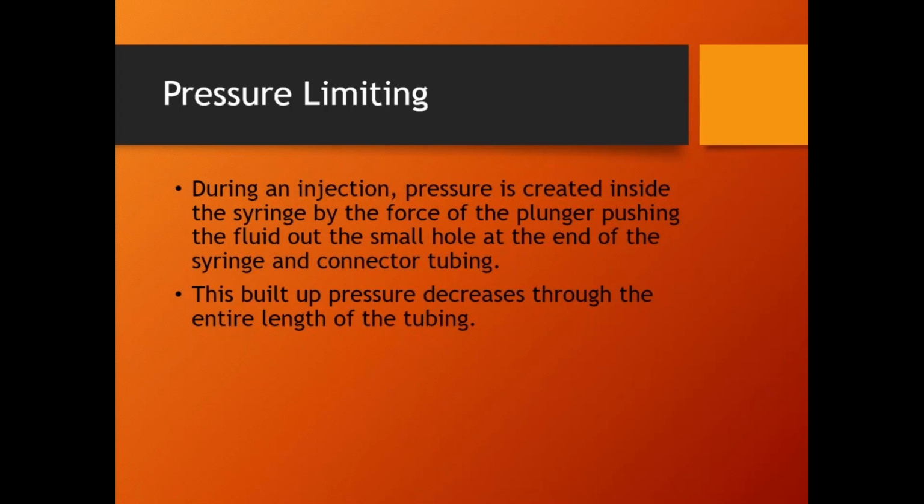How this works, and it's just the fluid, you have to just remember your fluid dynamics training. When we go from this 1.5 inch wide bore to this 2 millimeter wide bore up here, that's where we get the dramatic decrease in pressure. I mean, in here, it's 300 psi. Right here, we're down into the single digits. All right, and the closer we get to the opening it's lower and lower. By the time the fluid gets to the patient, we're in the low single digit psi's. All right, so that 300 psi or 1,000, 1,200 psi, that's not in the patient. And that's partly the purpose of what I'm talking about here.